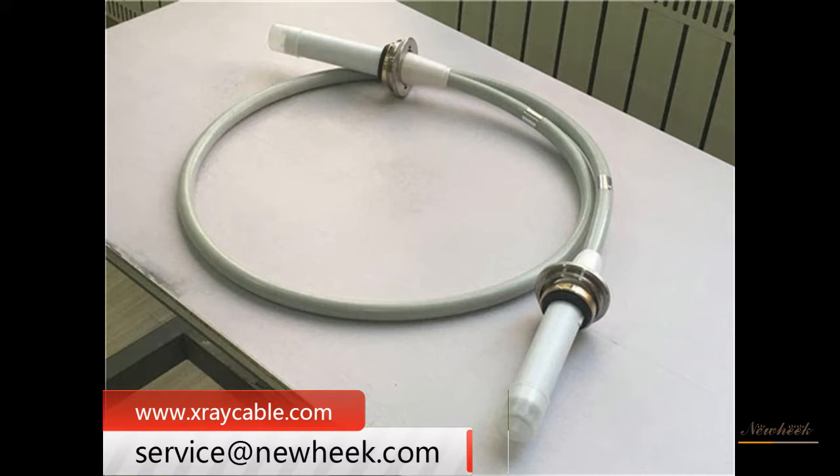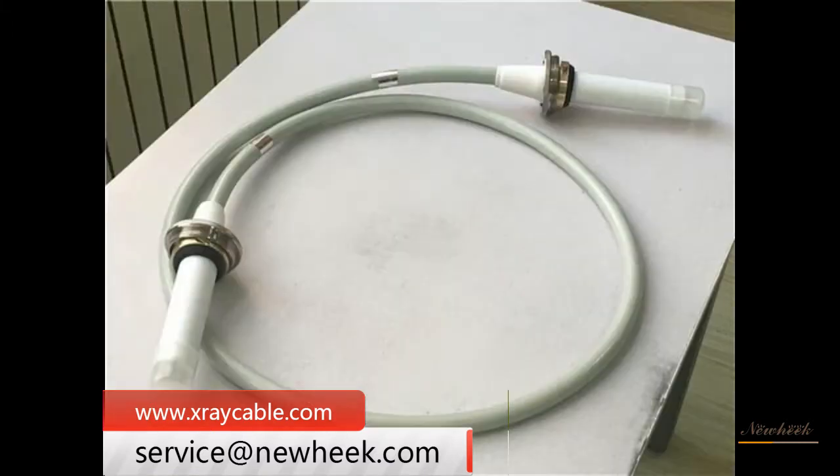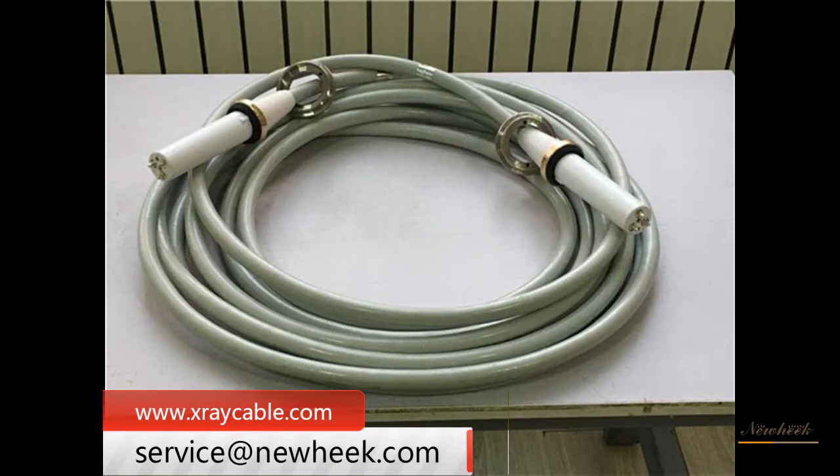Secondly, the use of high-voltage cable should be careful to prevent excessive bending. Furthermore, the bending radius should not be less than 5 to 8 times the cable diameter, to avoid cracks and reduce the insulation strength.